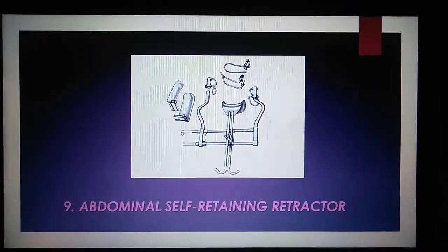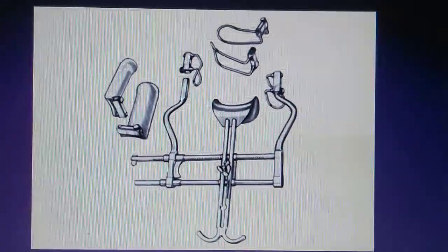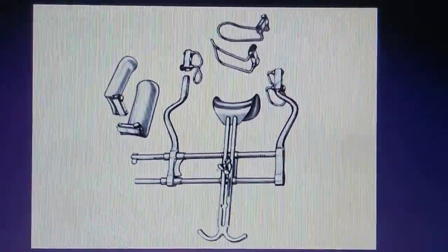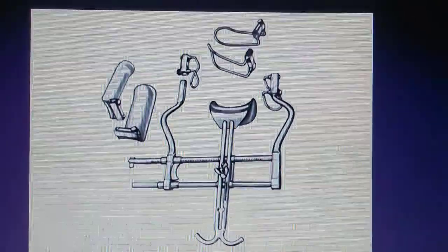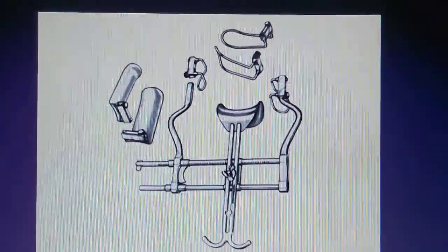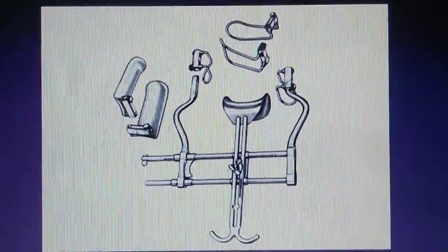The Abdominal Self-retaining Retractor is used during a laparotomy in which abdominal incisions need to remain open to uncover the area. Additionally, this retractor is self-retaining, which allows it to be held in place to allow the surgeon to focus on the task and avoid holding it.